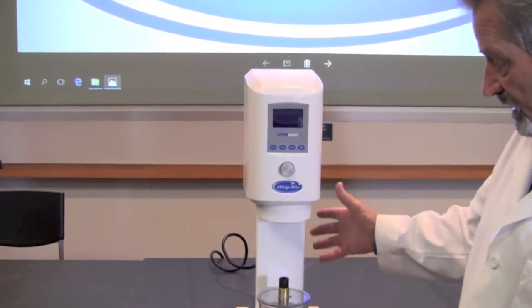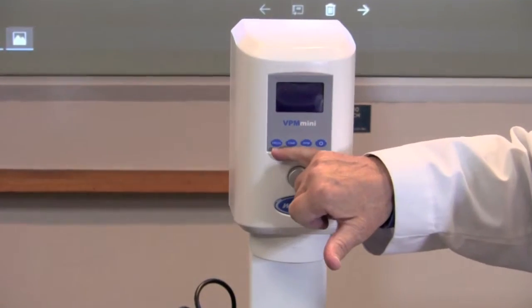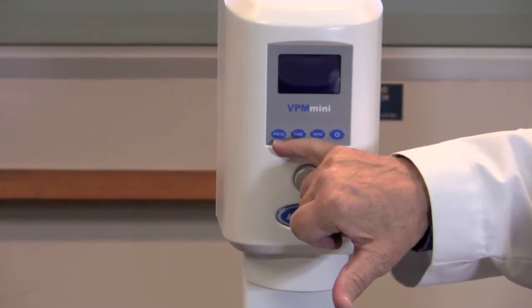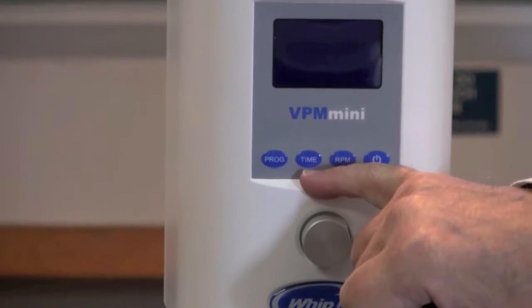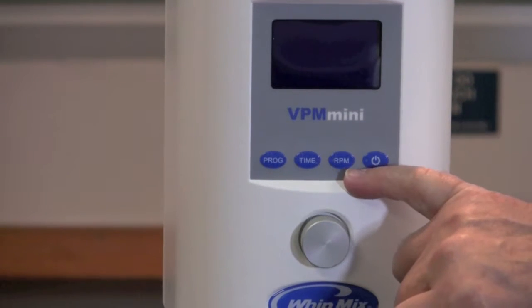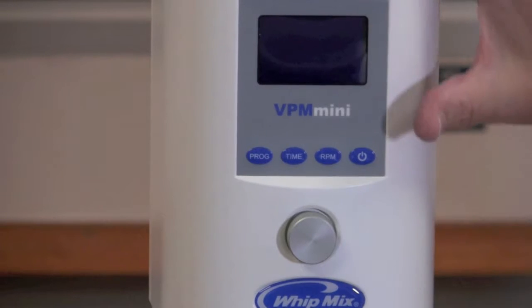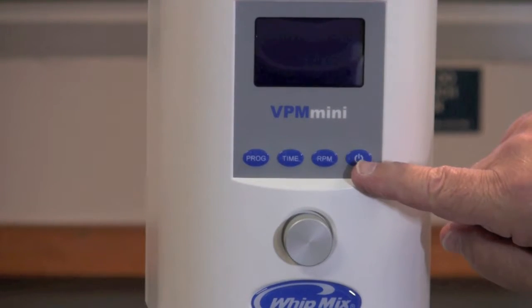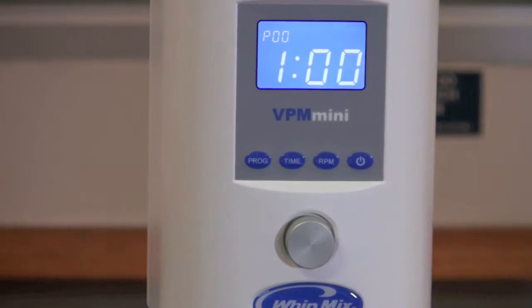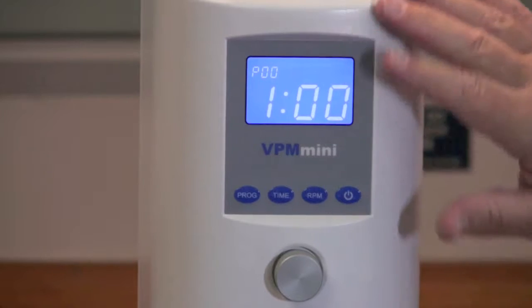When you get this all set up and ready to go, you have some options in the Mini. You have the program that you're going to use, the amount of time that it's going to mix, and the speed or RPM that the paddles are going to turn. To access that information we're going to use the on/off button right here on the face of the machine, and it will bring up what's currently in your machine.